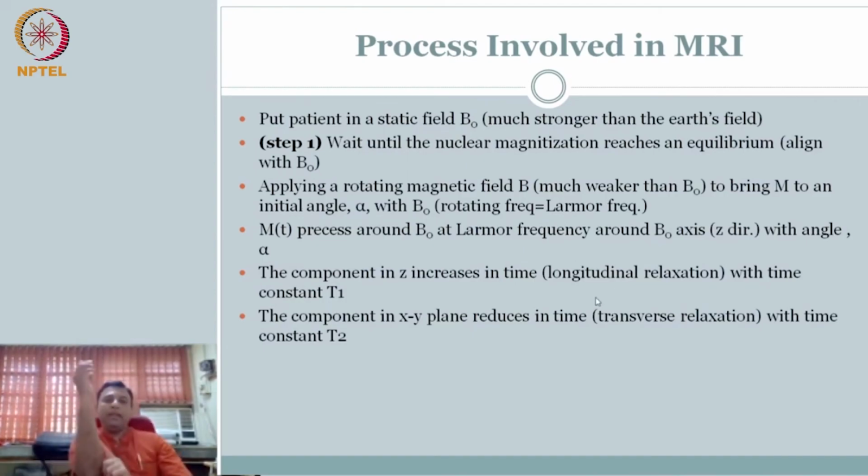So of course, just to complete the point, if I now say remove the external magnetic field, right? Now I say, oh okay, you all relax. What will you do? You'll go to your resting state, wherever it was. So that means if I remove the external magnetic field after I make you all obey the command, how fast you will go to your native state is a characteristic of you, right? Some may go immediately, some may go slow, some may take their own sweet time, some may not go. Well, let's not take that case here. But the point is, you are trying to relax, right?